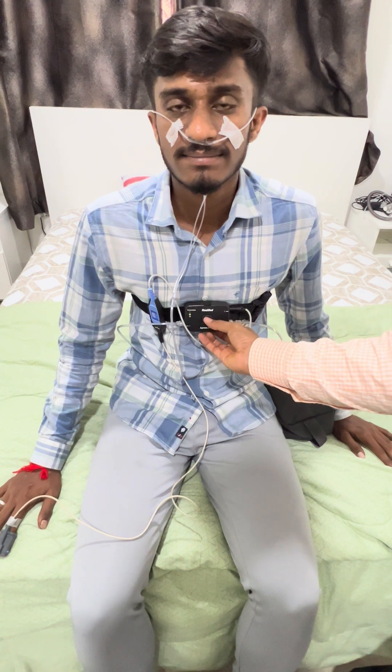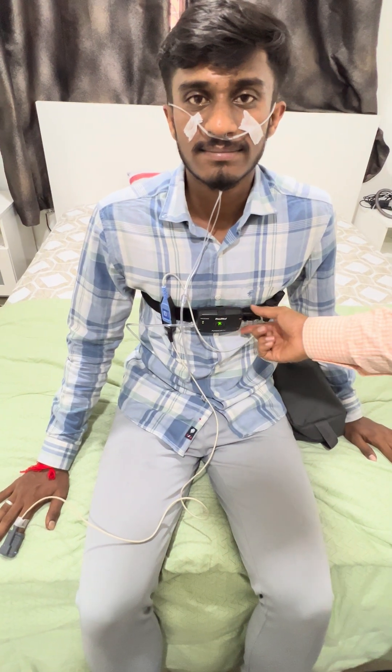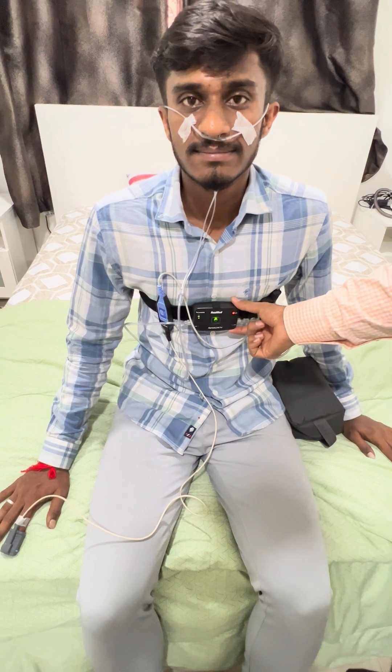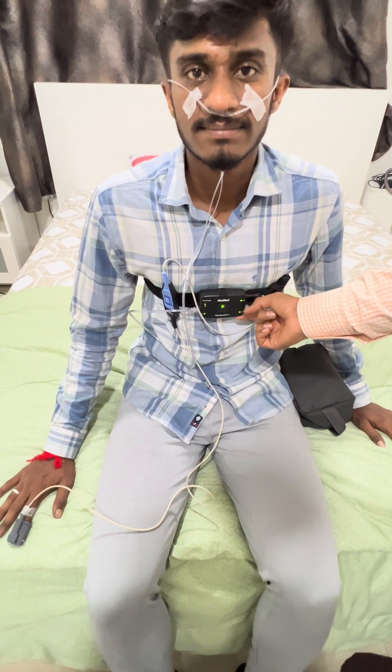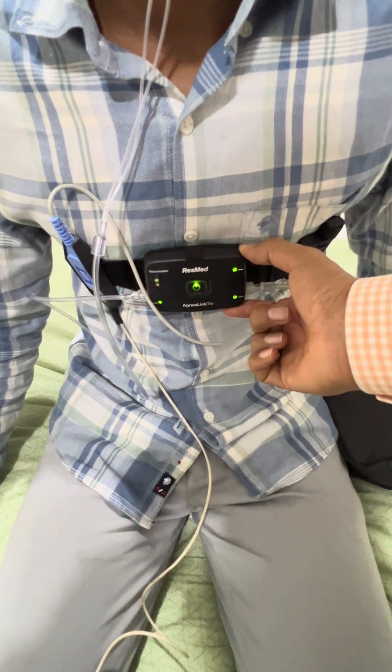After connecting all these things, press and hold the switch-on button. Once you click it, the green light will come on and all sensors will start with a red blinking light, then slowly the green lights will appear. When green lights are showing on all three points, that means recording has started.